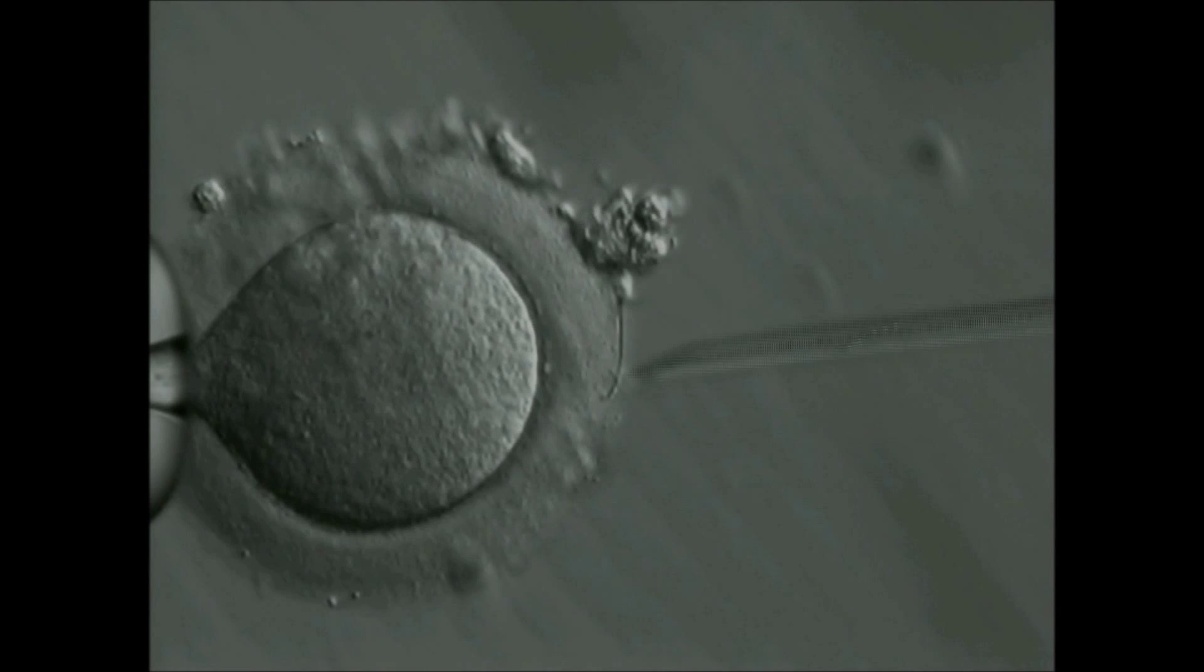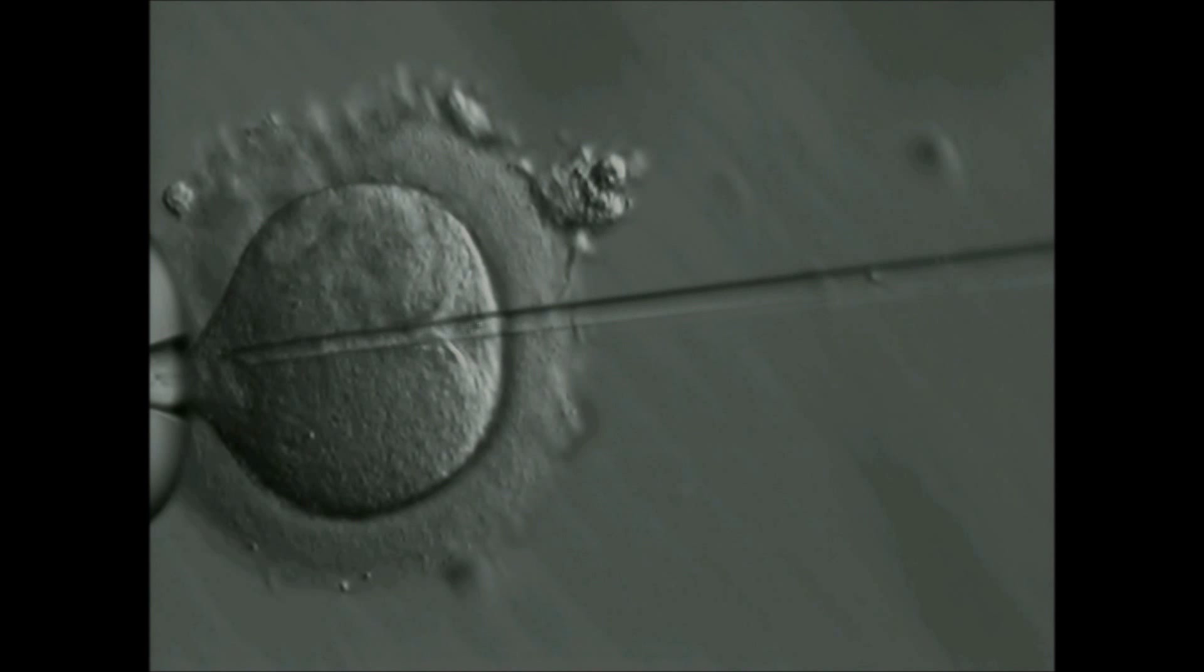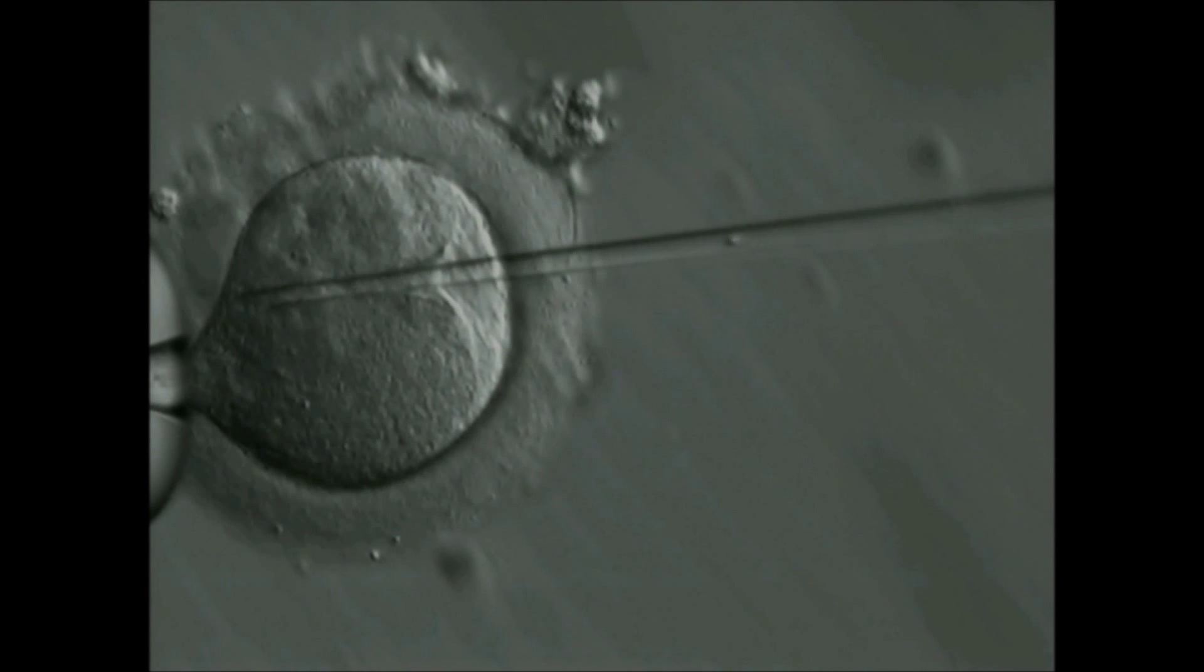After complex processing of the testicular tissue, the sperm are individually selected using this technique and live sperm are separated from the dead sperm by the HOS test technique and then used in ICSI with the partner's eggs to generate embryos.